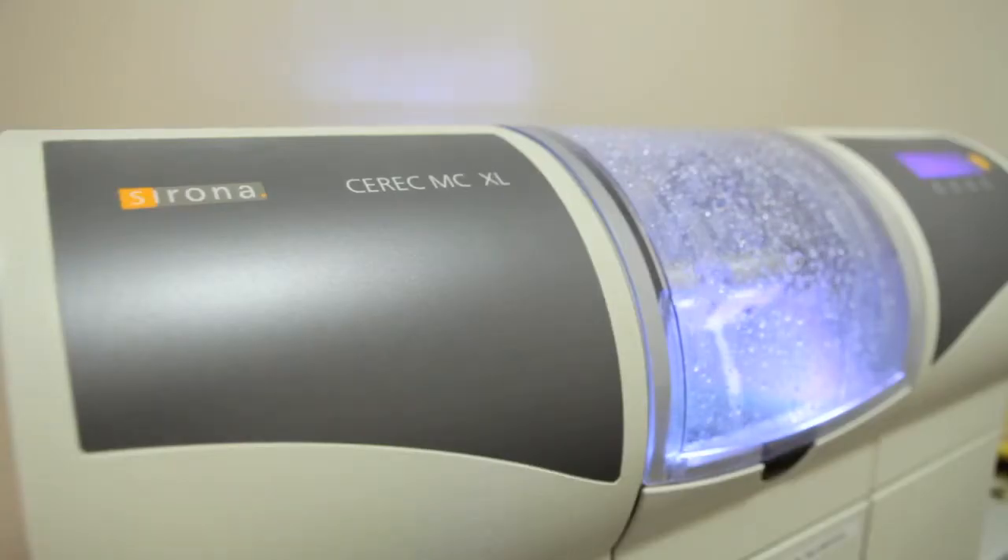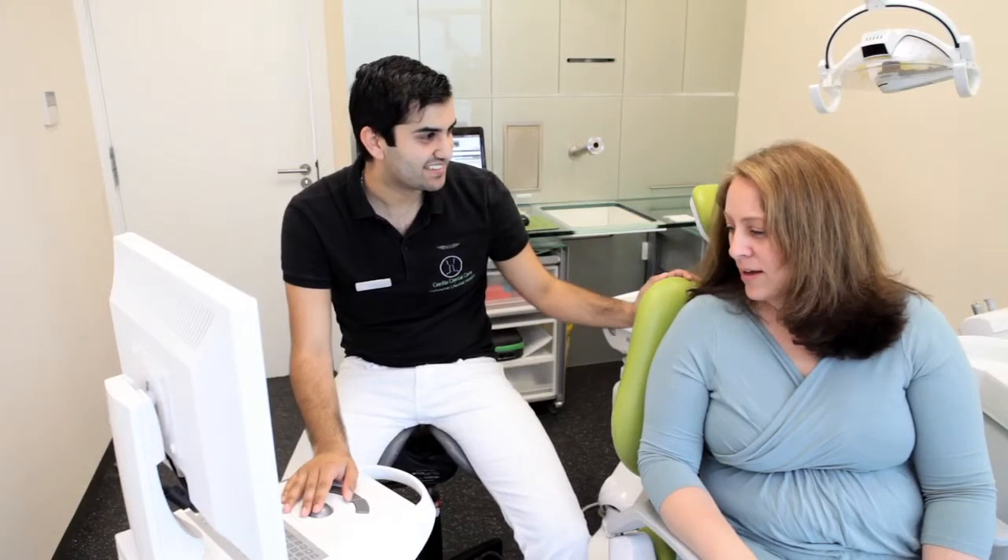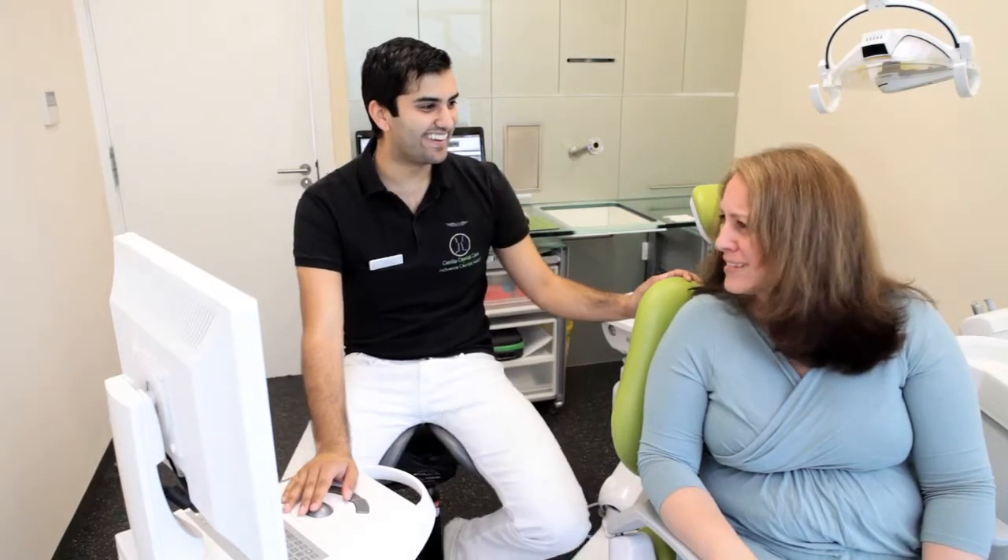The CEREC procedure is a unique way of making a crown. We digitally scan, we digitally take the impression, and we make the crown for the patients on the same day. A lot of our patients, once they've had a CEREC crown, the next time they need a crown, they want it done in CEREC.